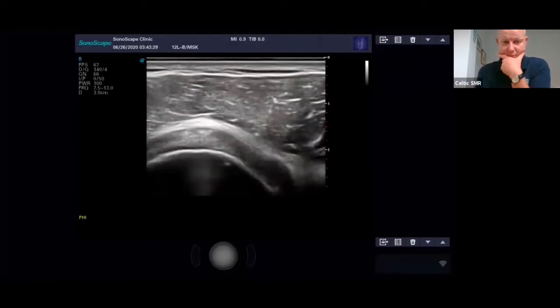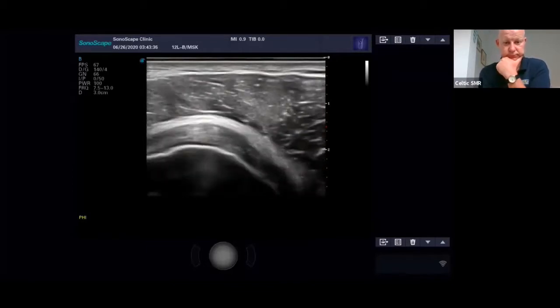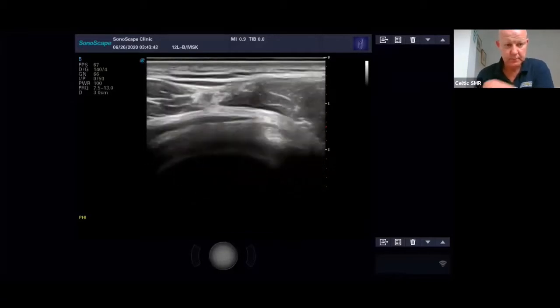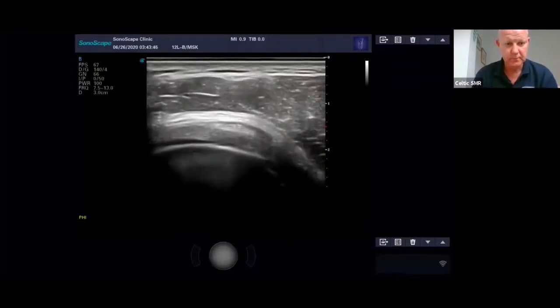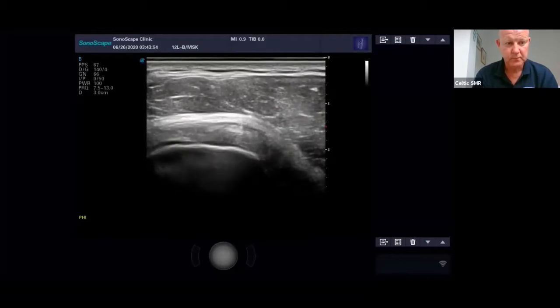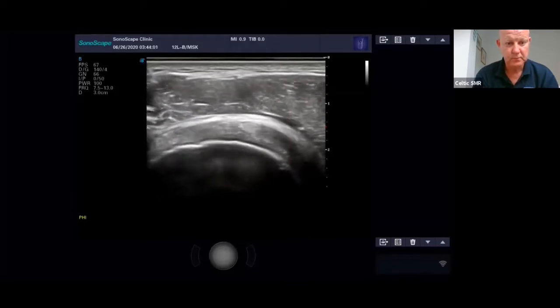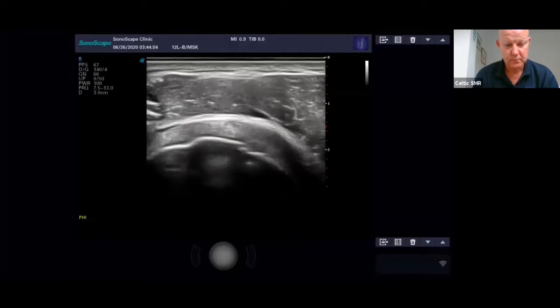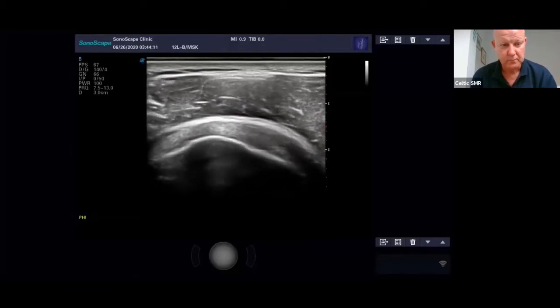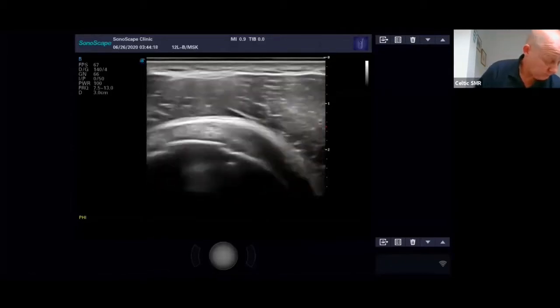But lumps and bumps, you might pick up the odd lump and bump in the shoulder, and always use Doppler for that. That's a definite must. Why, Adrian? You want to just clarify? Yeah, if there's any Doppler or colour flow within the lump or bump, it's obviously got some sort of blood supply, so they'll want to interrogate that a bit further. Ultrasound can be good for lumps and bumps, but you should use it with caution. Always correlate it with other imaging, because I've seen stuff that looks benign but is not benign, and vice versa. So the crossover is quite big. Just be aware of lumps and bumps, certainly.